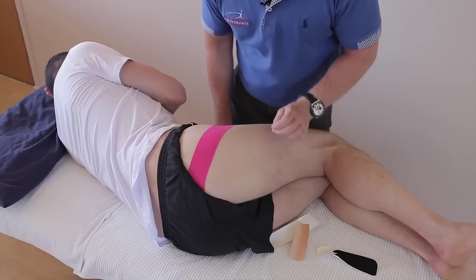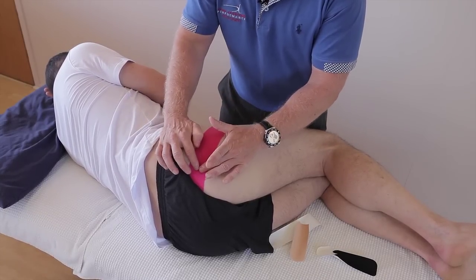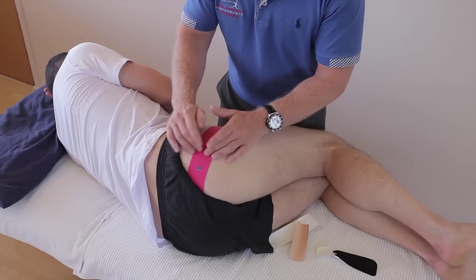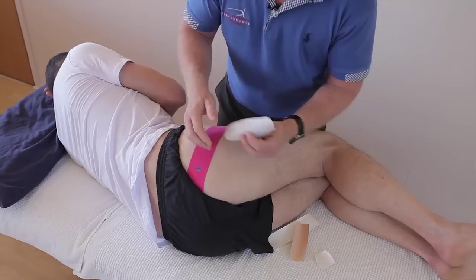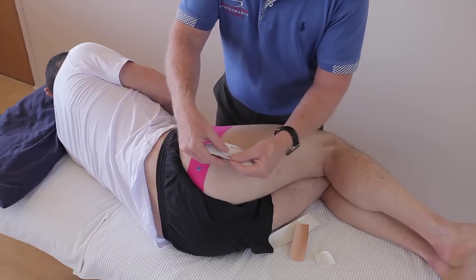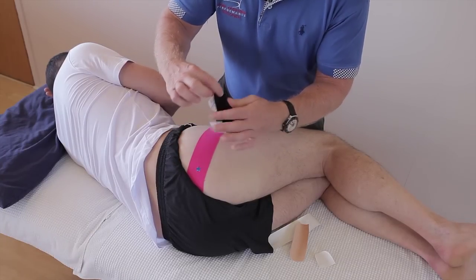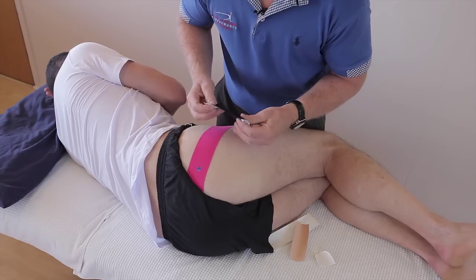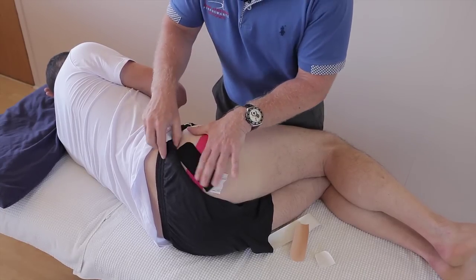I'm going to place the pain area just there. If it's slightly inferior, superior, medial, or lateral, you can apply the tape accordingly. Taking the first of the smaller I-strips, split the tape and peel it back, then apply at 100% stretch, back off a little bit, like so.